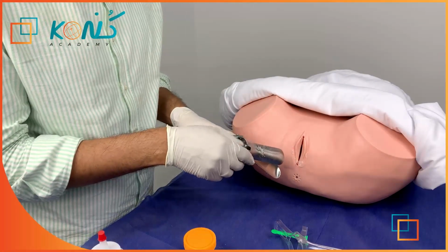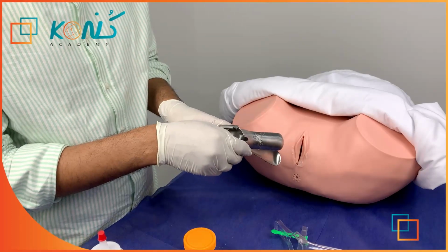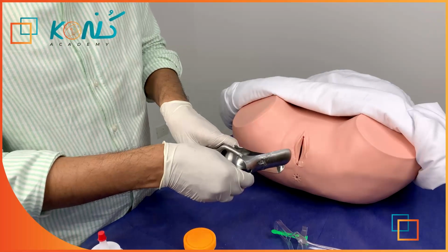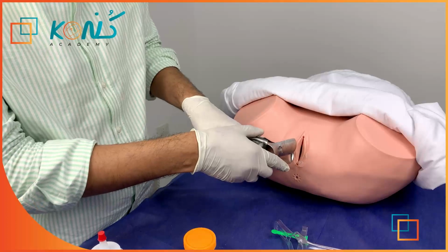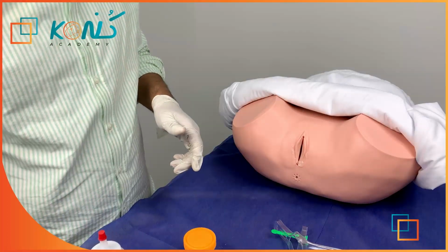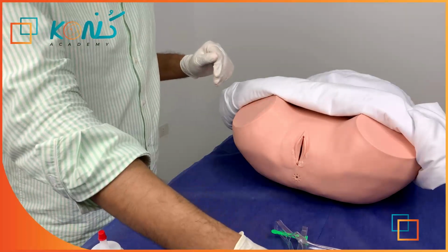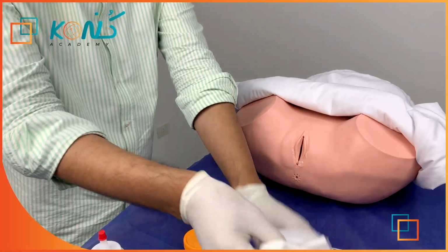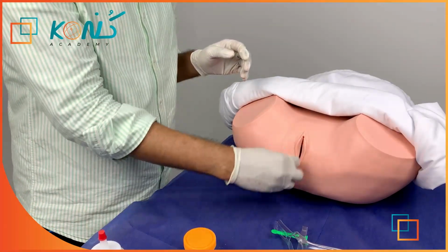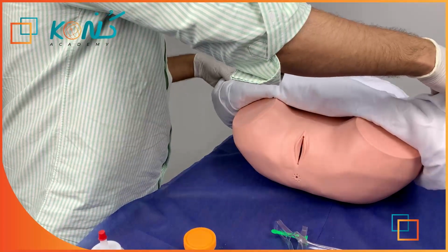We take it out slightly, 1 inch, maybe 2 inches. Make a half closure, then we rotate it and take it 1 inch more. We close it completely only when we are about to take it out. All right? Then you will take it out this way. Thank you, Mrs. We have almost done. We can clean this part and ask our patient to dress herself up again.